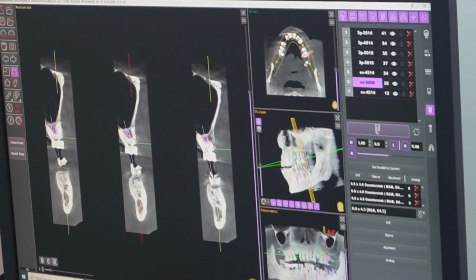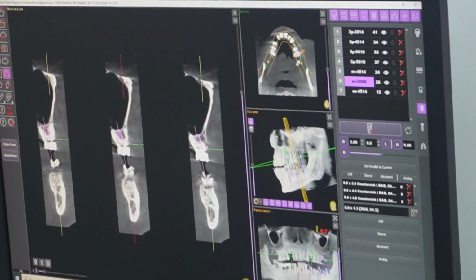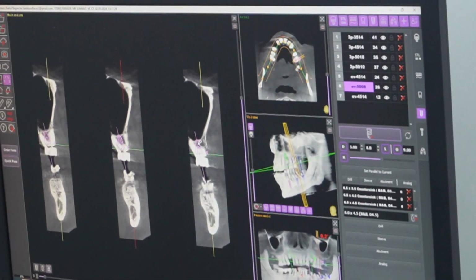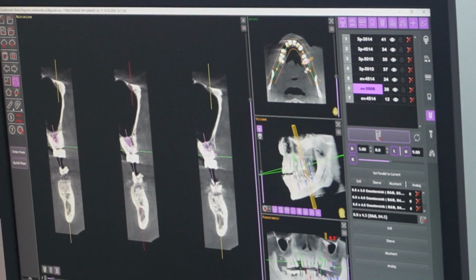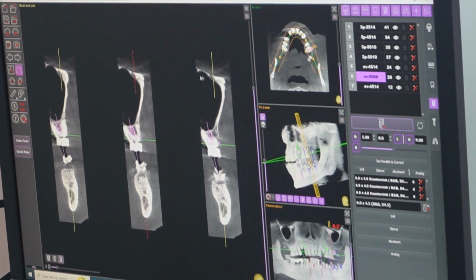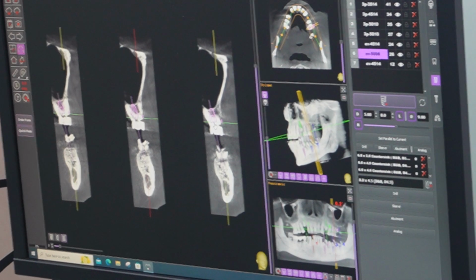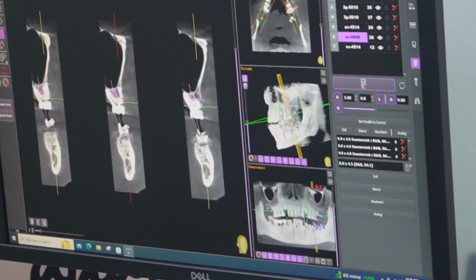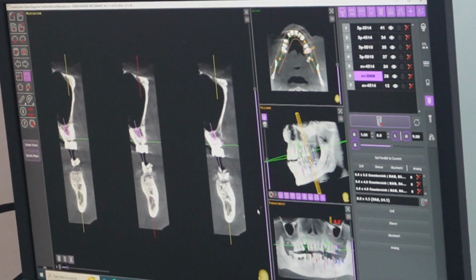I have very little bone even after extraction. So after extraction, I am going to place my implant between the roots of this tooth, and maybe I'll be pushing the floor of the sinus. This black empty cavity is the sinus, where I'll be pushing my implant into the sinus, and I'll be able to engage 8 mm, 5 mm, 8 mm of active implant.